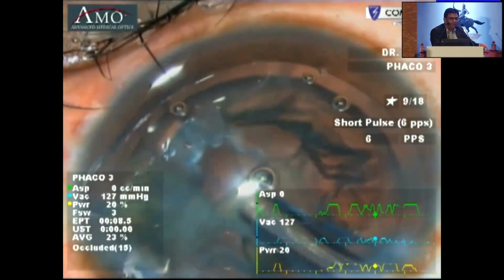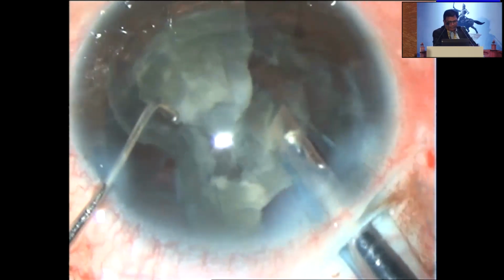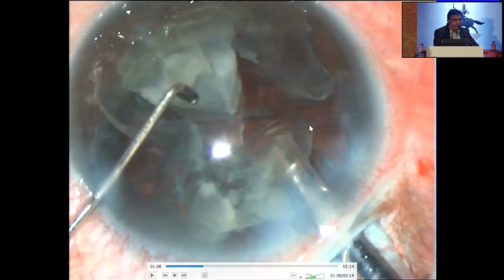So this is the phacodynamics. Every machine will work on this principle. This is another very classical teaching figure in my training program. After 2-3 days, doctors started doing something. But if I do not show this picture, this video to them, on the 4th day they may rupture, on the 5th day they may rupture, because this is very important for them.